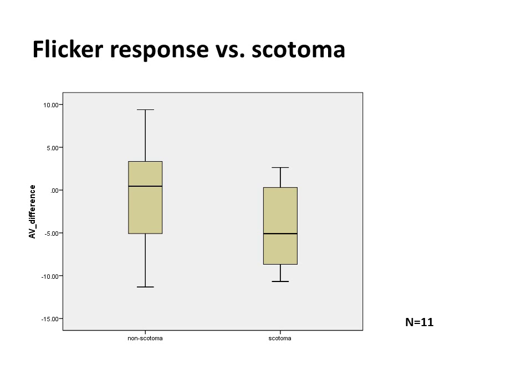It gets more clear if we compare the AV differences. Here the decrease of the AV difference in the scotoma area is about 4%, and that was statistically significant compared to the zero baseline, to no change.